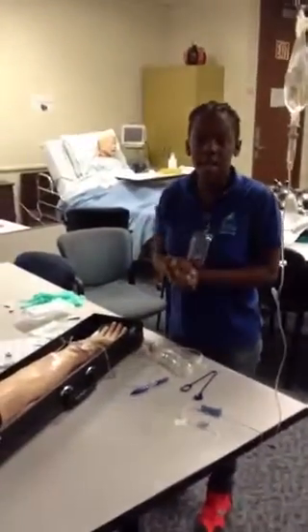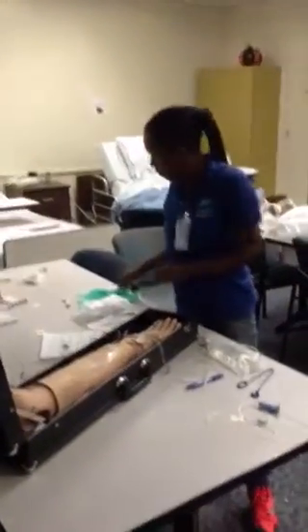I'm in the patient's room. I'm going to wash my hands and apply my gloves.